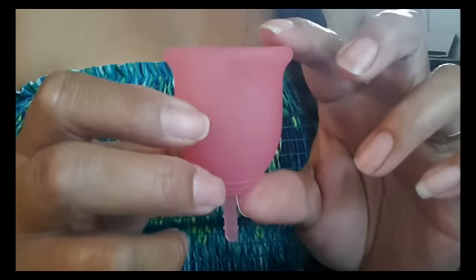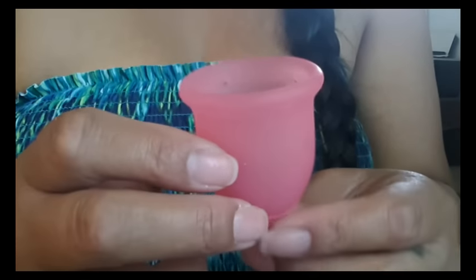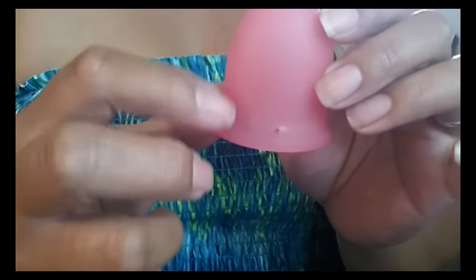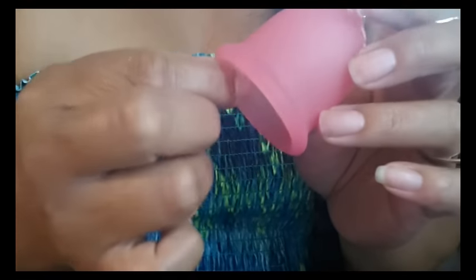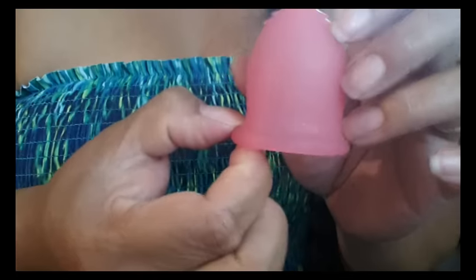This cup holds 30 milliliters — that's an ounce of fluid to the very top of the rim — and it doesn't have a secondary rim because it is a bell shape. Usually bell-shaped cups don't have that secondary rim. Similarly, the Super Jenny cup doesn't have that secondary rim either, but it does get a little more thick at the rim.